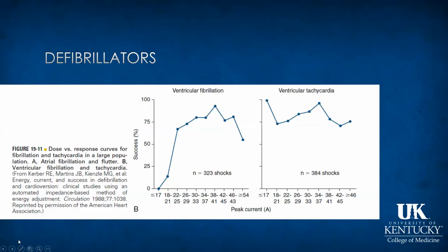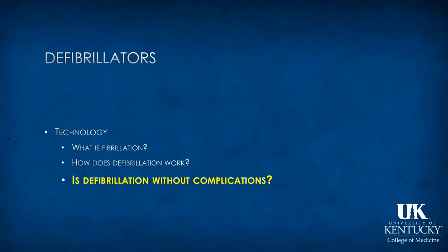These graphs show a dose-response curve showing the relationship between peak current and clinical success. This is a fairly old slide, but does show you the dose-response relationship.